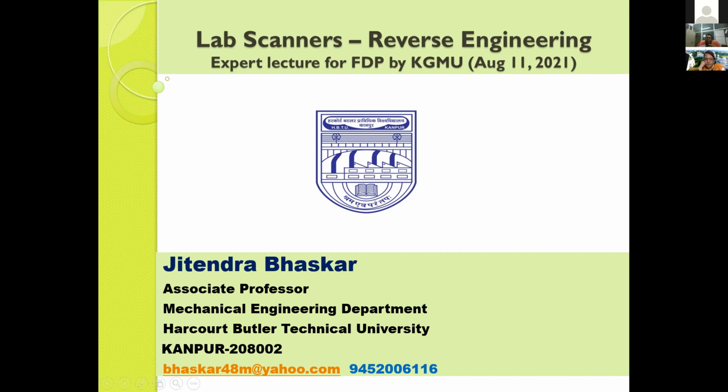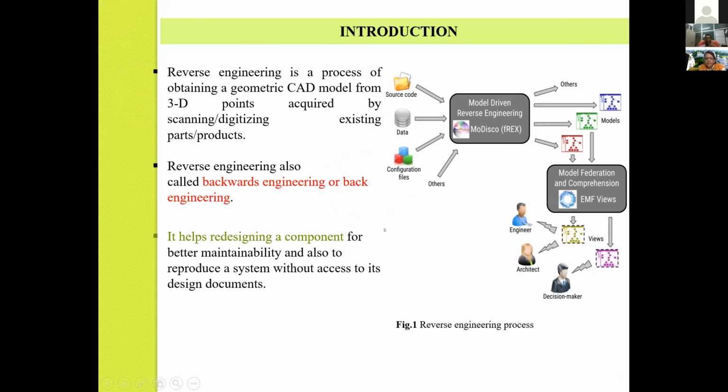I would like to throw some light on reverse engineering: if any object exists, you take the geometry by scanning or by any means, and we remodel it for our own purposes.